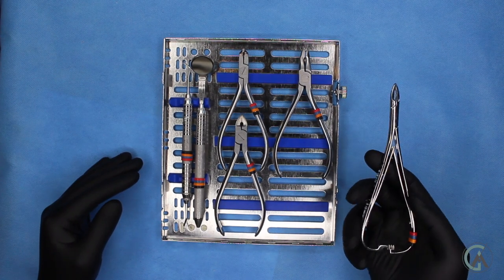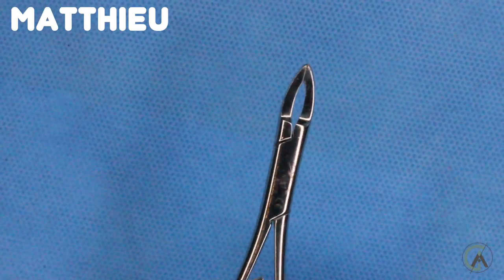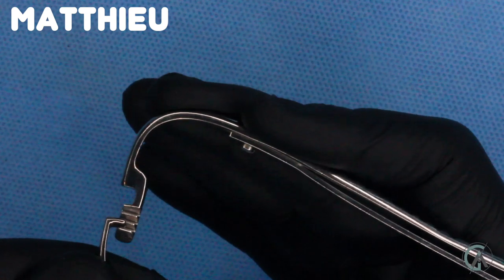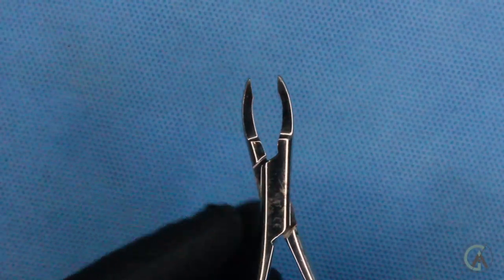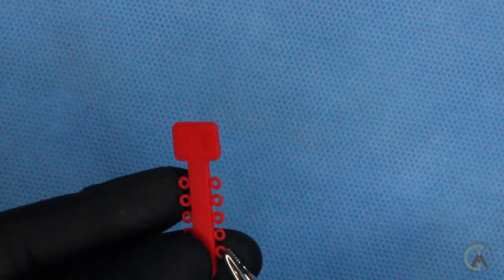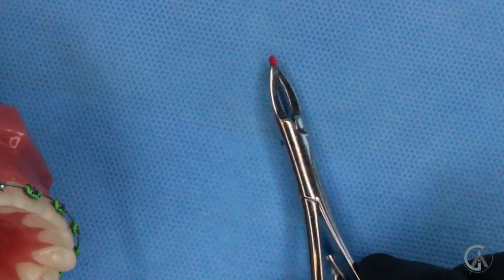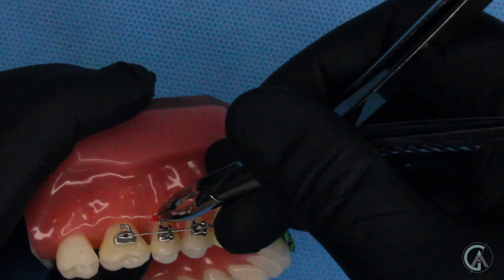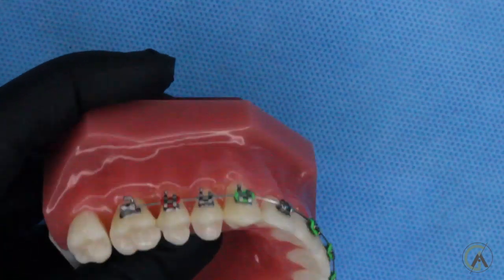A lot of you guys are familiar with this instrument — it's always called the one that makes the clicky clicky noise. It's called a Mathieu, or a hemo. It makes that clicky noise and it has a locking apparatus that when we squeeze it, it holds shut, and when we squeeze a little more, it releases. This is what's used to put on power chains, steel ties, o-rings, and color ties. So for example, if we want to put on a red color tie, we'll pinch it from the corner and tear it off the strip of o-rings, and this instrument will hold onto it — I don't have to hold it, I can rest it down and it'll keep holding it shut. Then we tie it onto a tooth and squeeze again to let go. That's how a Mathieu is used.